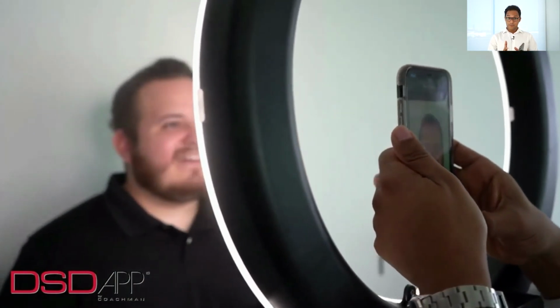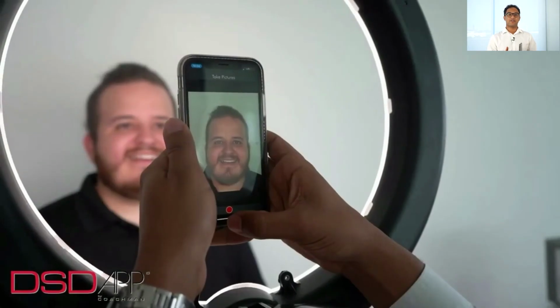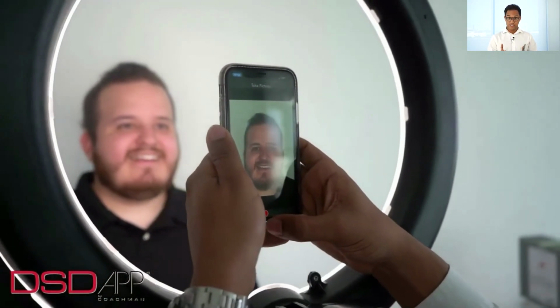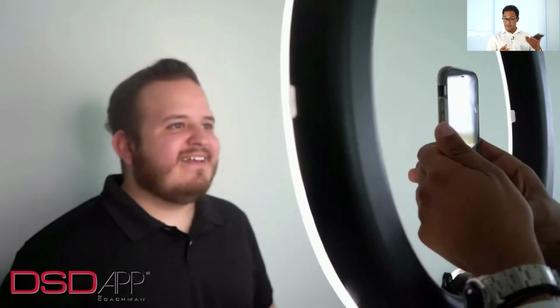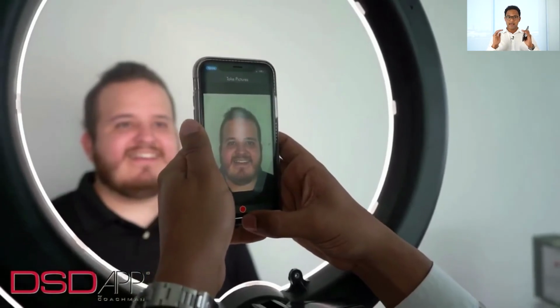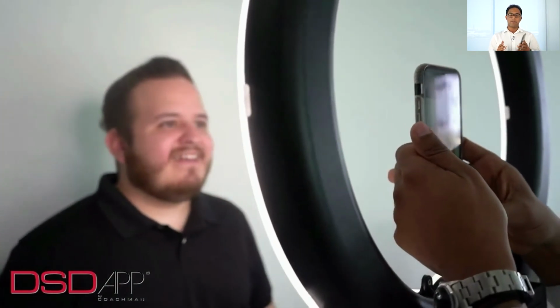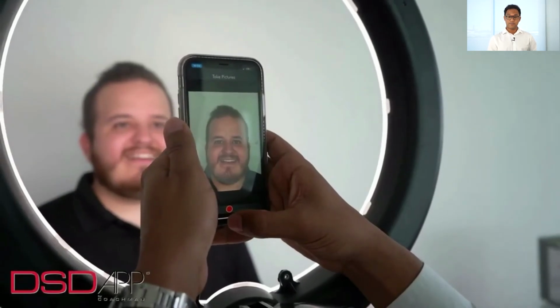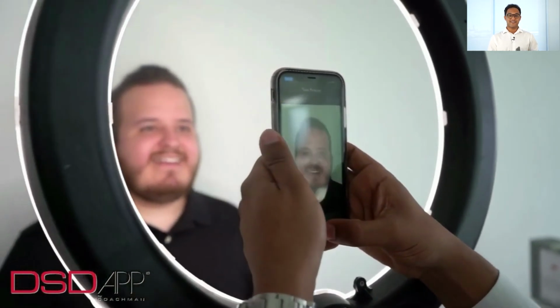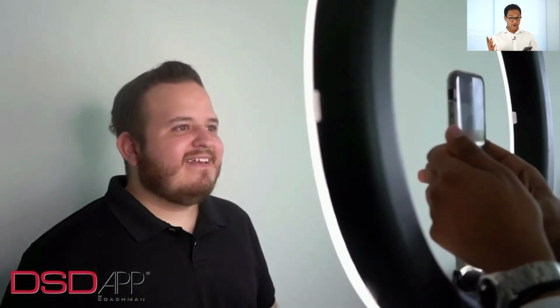But just as a note, whenever you start a smile design, the first step is to take a frontal facial picture of your patient. And as you see on the screen, you should have a solid background, such as a white or dark wall. Make sure that the patient is looking straight at the camera and that your iPhone is also set straight. Make sure you have great lighting, such as a ring light, as you can see in this video. And also, make sure that your patient is smiling with the mouth slightly open. So let's start our demo together.